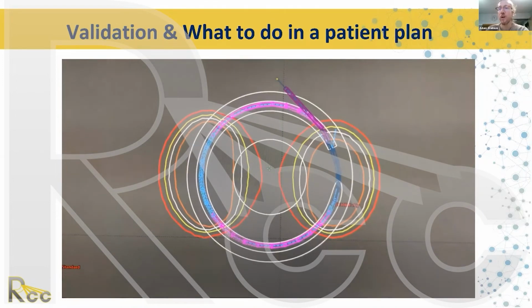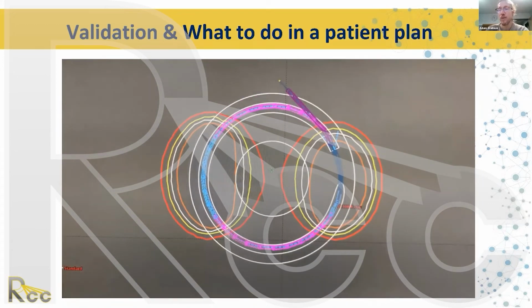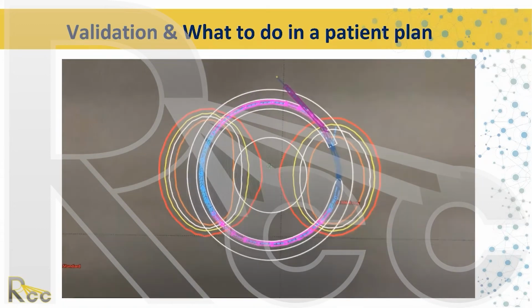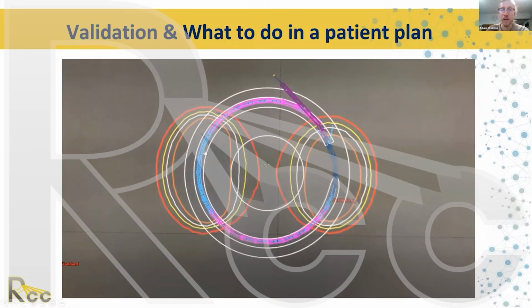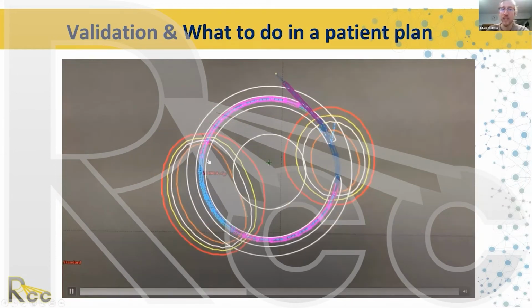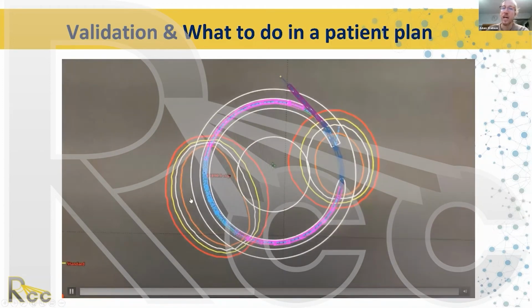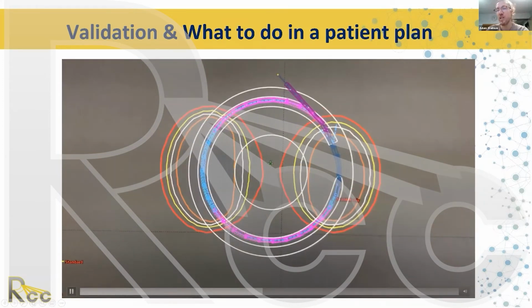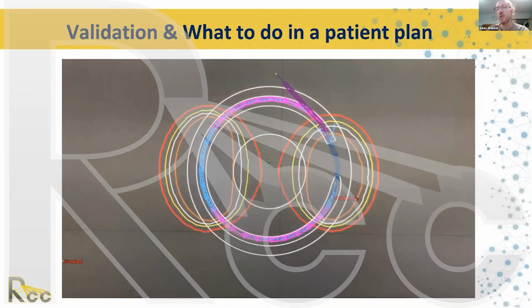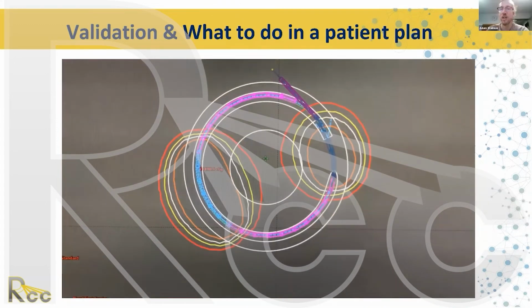And then whatever our offset is from commissioning, then we apply that offset. You can see the blue is going to move shortly. Now I just applied that 5mm offset that I commissioned. It's moved. But if we actually delivered it on the patient, the dose distribution in the patient would look like this, 5mm closer to the distal end. So there's a delivery plan.